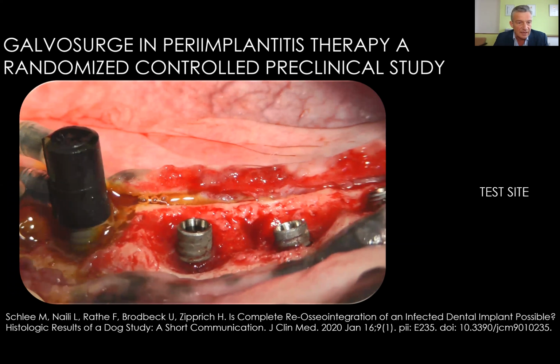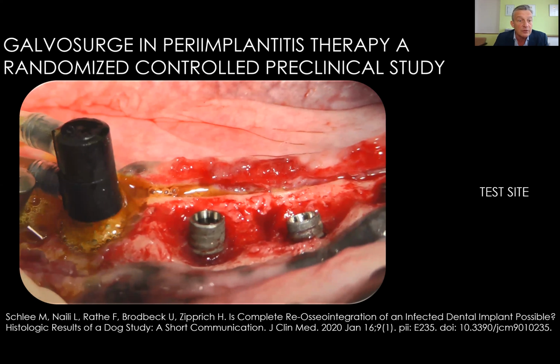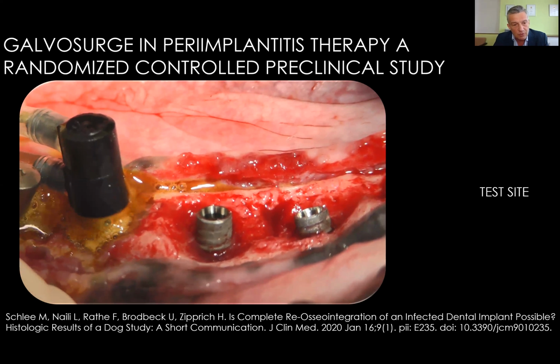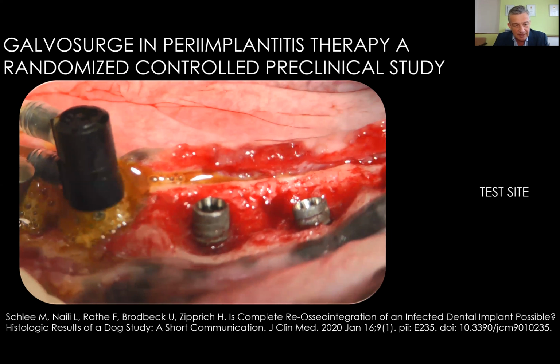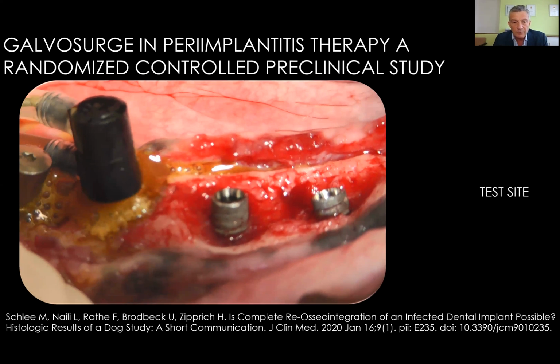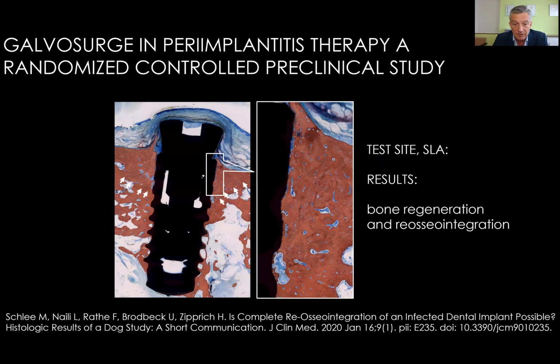Here you see the clinical application of the test device we used at that time. Now it's a little bit more modified and improved, of course, which was used for cleaning. And we saw, I guess for the first time in literature, published in the Journal of Clinical Medicine, a complete re-osseointegration of some of the implants.